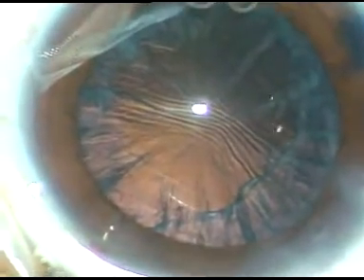A lot of cortical matter is remaining in this case. I am using bimanual irrigation aspiration. The machine being used is the Oertly Cataract-3 FACO machine. This is a beautiful bimanual irrigation aspiration probe - very slender. The machine has very nice flow, and if we can balance the inflow and outflow, the chamber remains very steady. It is true for any machine - if we can balance the irrigation and aspiration, the anterior chamber can remain very stable. So, the cortex is removed.